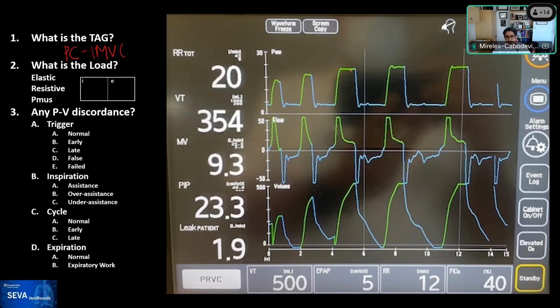You can compare this breath, I'm going to call it breath number 3, and breath number 5, which are probably the same length, but breaths 1, 2, 3, 4 seem different. Sorry, breath 4 seems a different length. That makes us suspect that on breaths 1 and 2, these are probably spontaneous breaths. They have different I times, and the breath cycles off at that period of time.